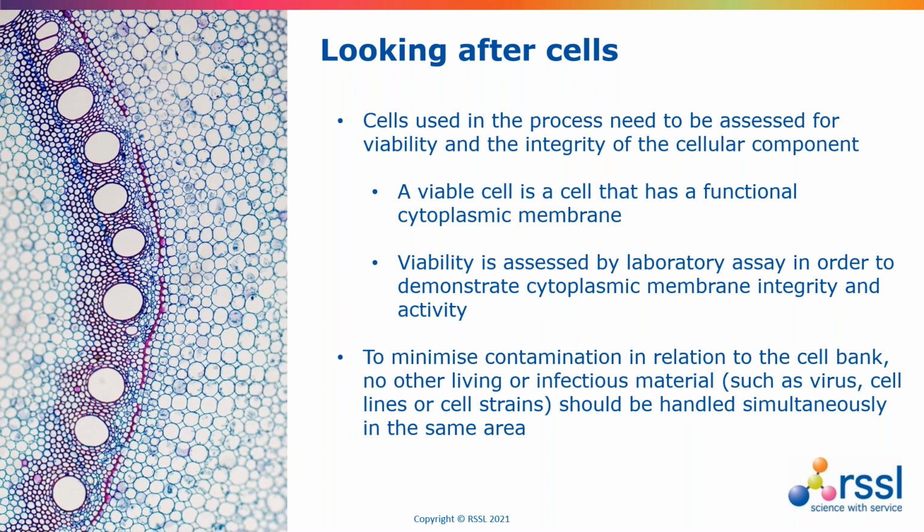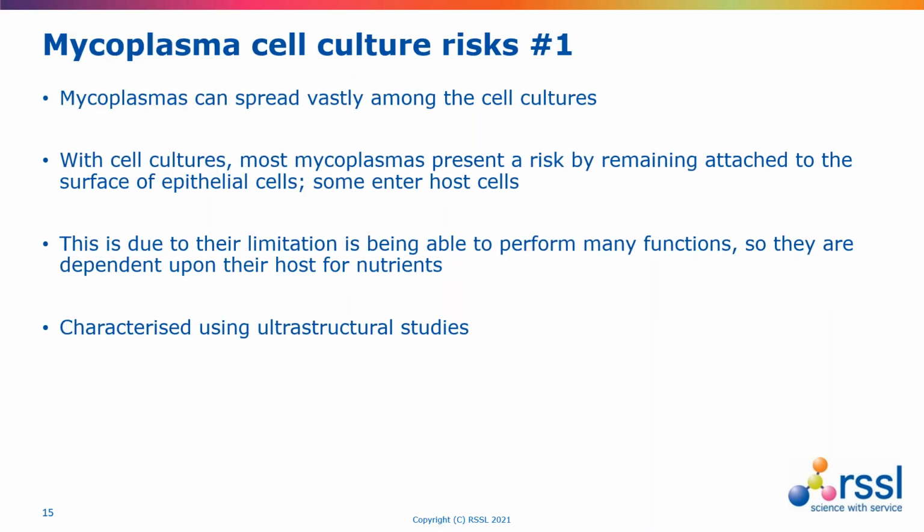And it's very important that we protect the cell bank from viruses, other cell lines, or cell strains. So there's a lot of work involved in the upkeep of cell lines in general. But the topic we're interested in is mycoplasmas. If an infection does get in, mycoplasmas can spread vastly within the cell culture, and there's also a big risk to other cell lines within the same facility.